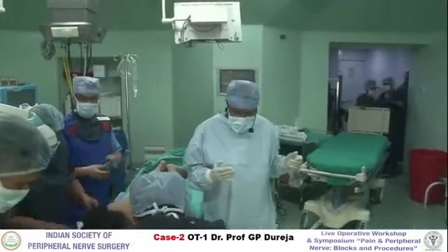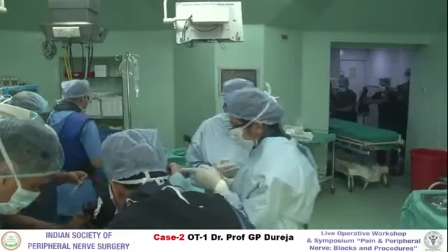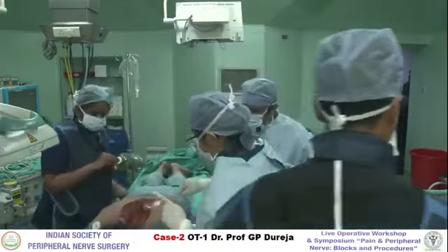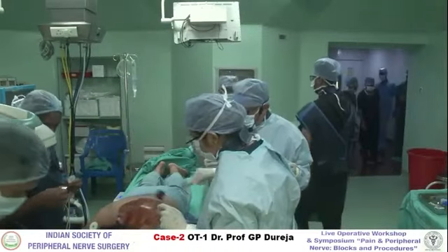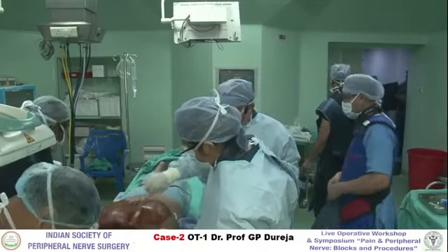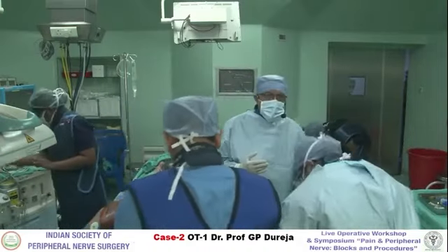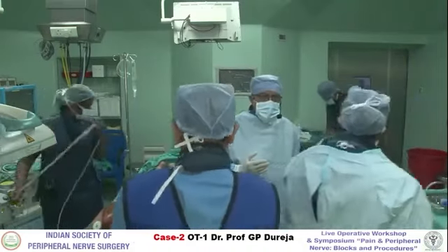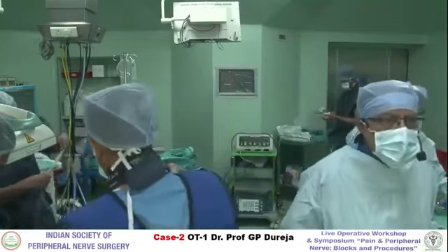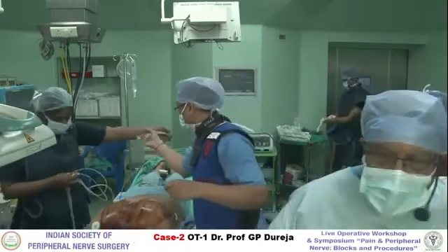Another question is, should we dilute the contrast while doing the radiculogram? I think no, we should not dilute because we need a hyperbaric solution there. Actually, during adhesiolysis, sometimes you may need to, because you are using so much dye. But in normal transforaminal or epidural, you are using hardly 1, 2 or 3 ml. In transforaminal, obviously you are using a smaller volume. Just see how much contrast you need for reaching that nerve root or DRG involvement and the epidural.